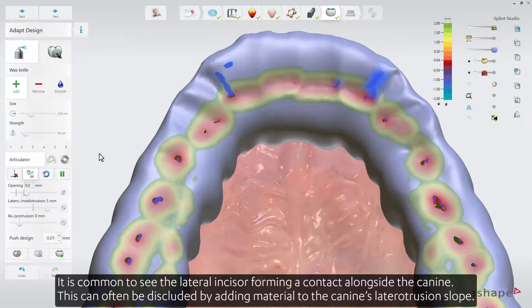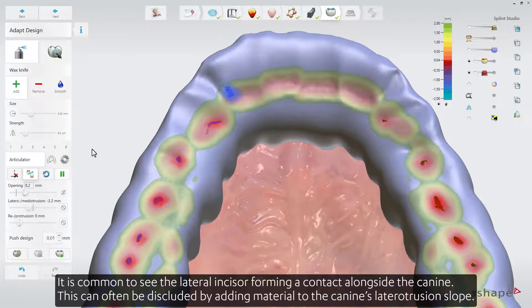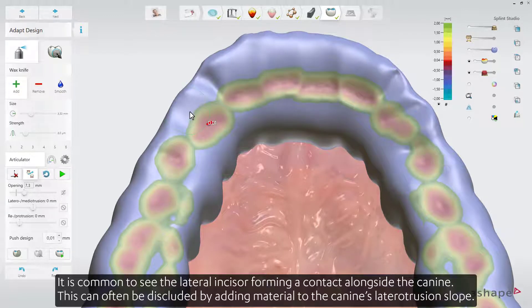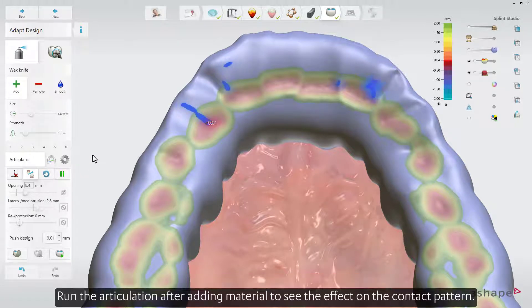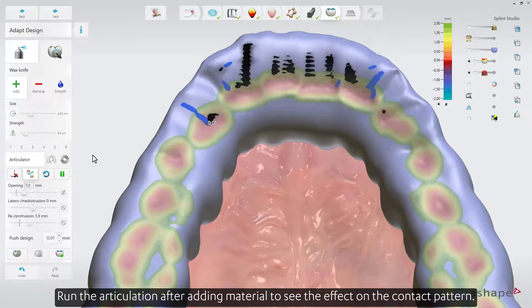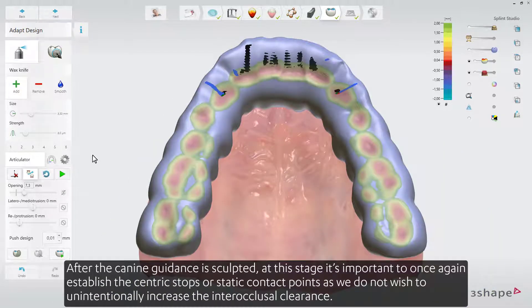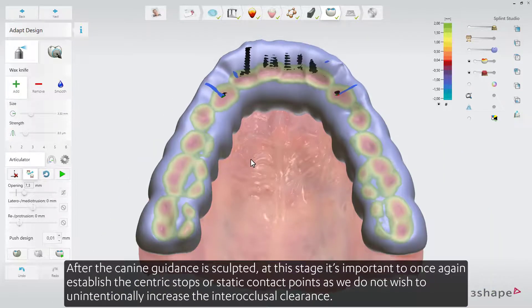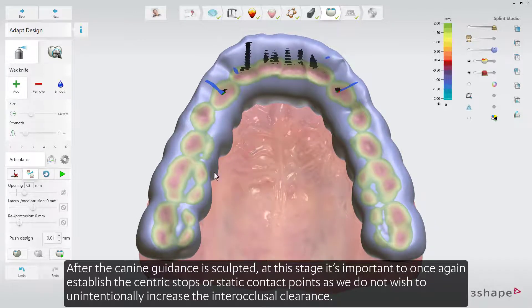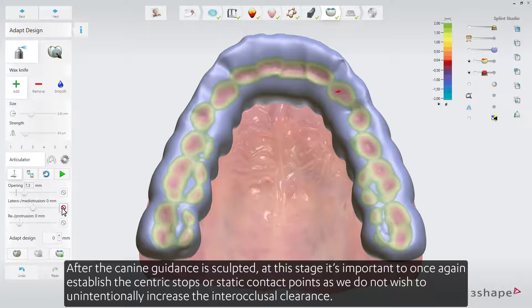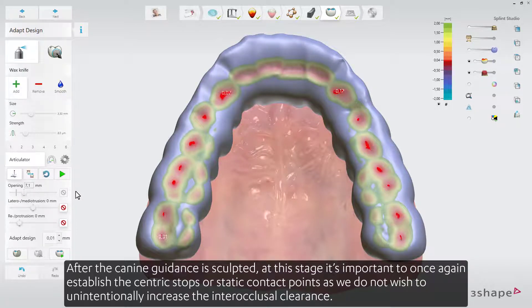It is common to see the lateral incisor forming a contact alongside the canine. This can often be discluded by adding material to the canine's Lateral-Otrusion slope. Run the articulation after adding material to see the effect on the contact pattern. After the canine guidance is sculpted, it is important to once again establish the centric stops or static contact points, as we do not wish to unintentionally increase the interocclusal clearance.